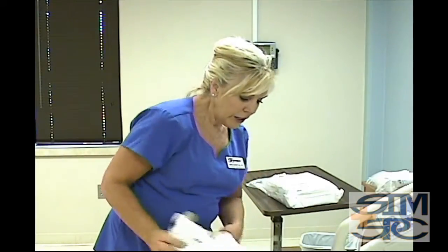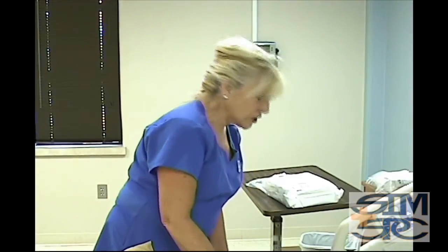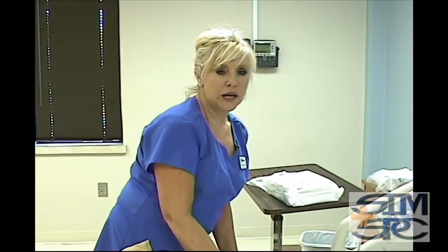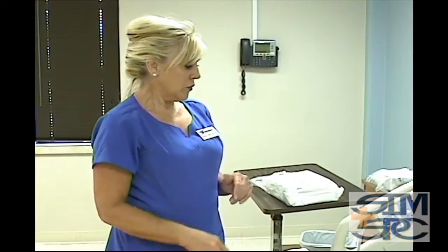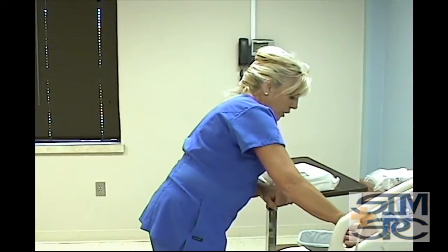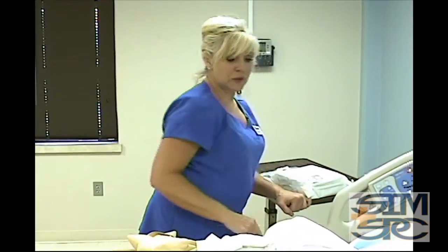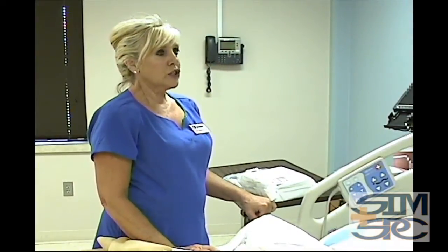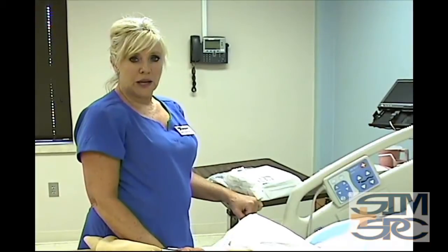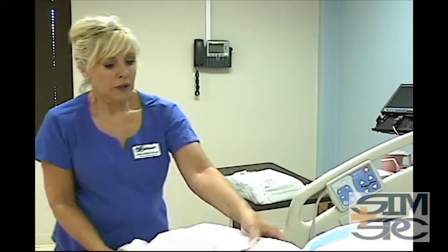Once you get to that part, you're going to look at the armband and check the allergies, ID the patient, and see if they're allergic to latex, betadine, peanuts, shellfish, or tape. After you ID the patient, then you can go ahead and get the patient up to a working position for you. Also, you need to make sure that you have the room with the door shut to give the patient as much privacy as you can. Make sure that the lights are on so you can visualize. Once you start to place the catheter, you need to have good visual lighting.